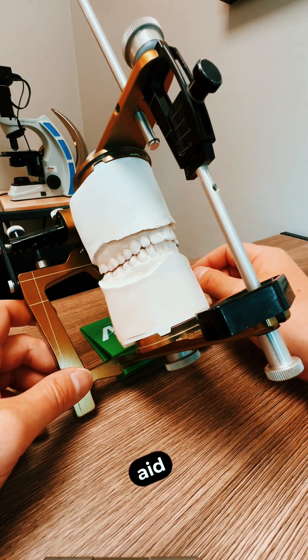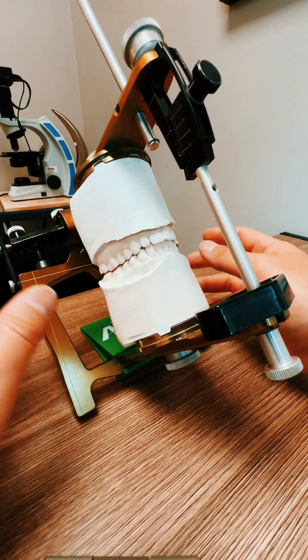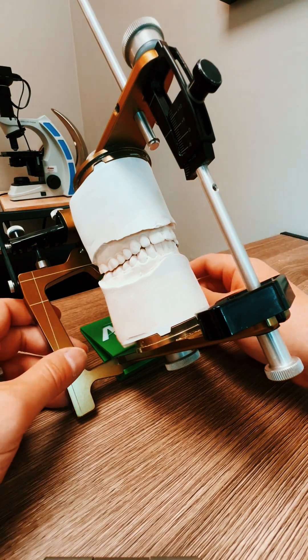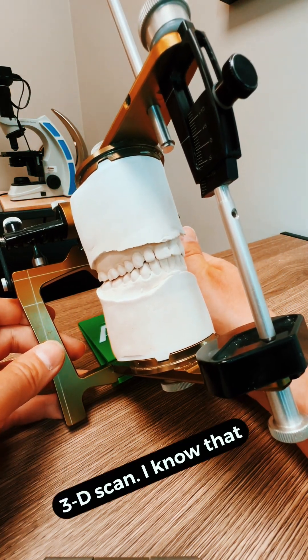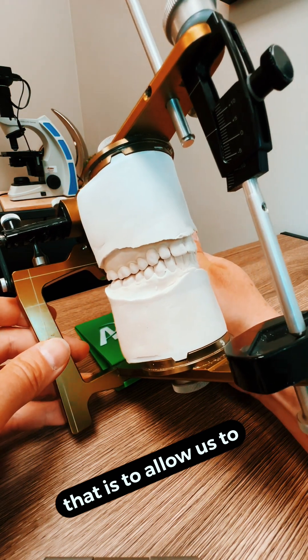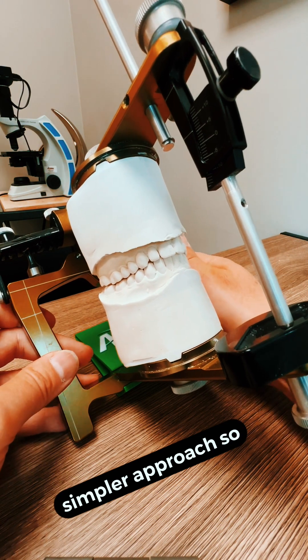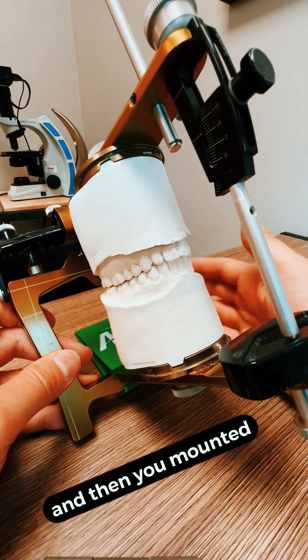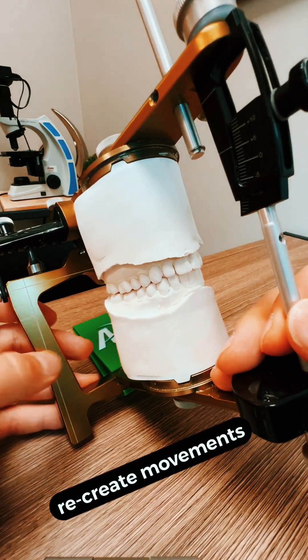And it's a really good aid. Oftentimes when you come in, you'll do a diagnostic scan. A lot of times if you take a 3D scan, I know that there's some software developed in the market to allow us to see how a patient chews. But this is usually actually a much simpler approach. So you take models of the teeth and then you mount them onto this jaw simulator, and you're able to basically recreate movements.